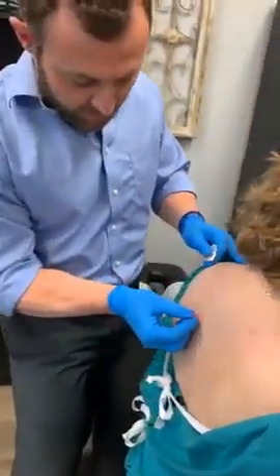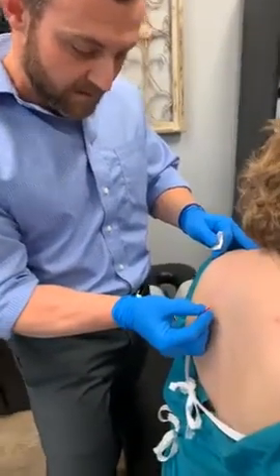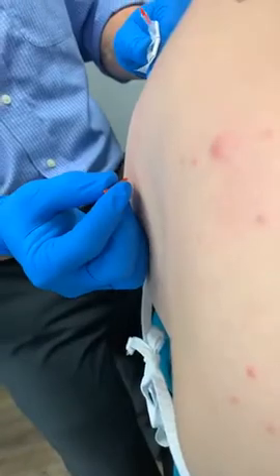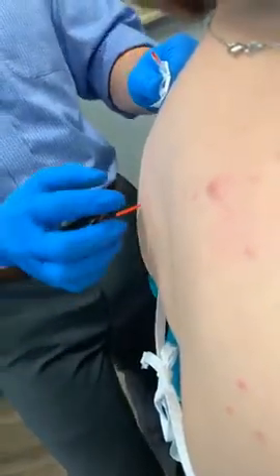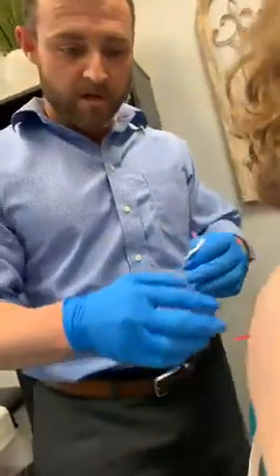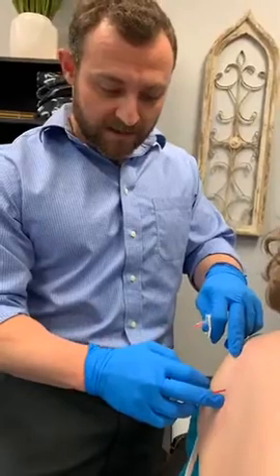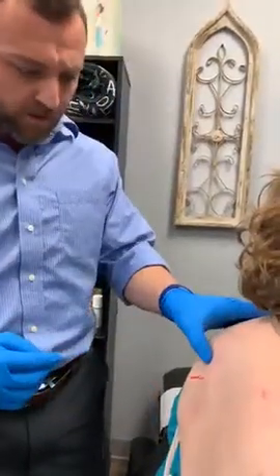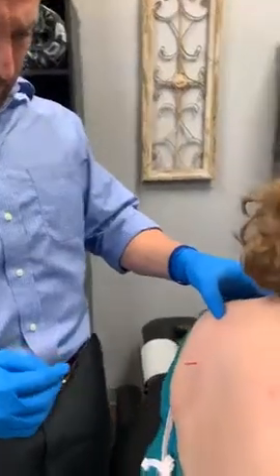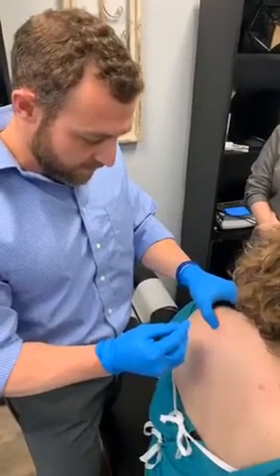Okay, so we just go in, and when you feel the needle pass through the skin, you then feel it hit the taut band within the knot, and she can feel that. It's a little bit of pressure, and we leave it right there. Once it evokes a twitch response in the muscle, or we feel the muscle start to dissipate, we feel it right in the knot. It'll make that go away. So we'll come around the top part. And we got one right through here.